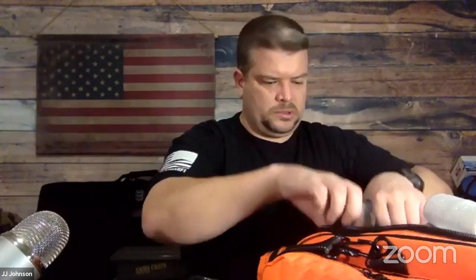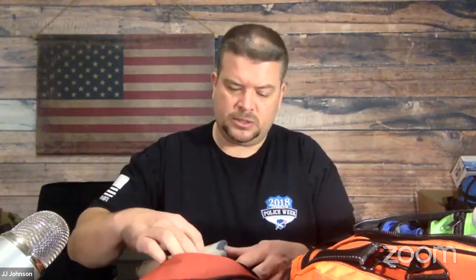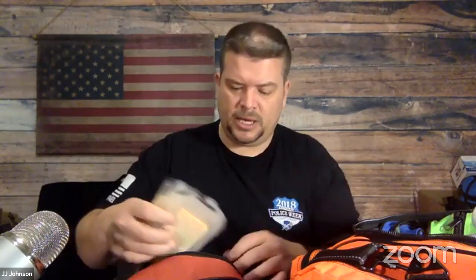And let's see. Okay, so the red one, I have multiple different subcompartments like this. And so the idea behind this was that each one has a color. And so this one is kind of more of the bleeding pouch. And you can see it's got some stuff in here, and you can grab that pouch and then take it and deal with whatever.